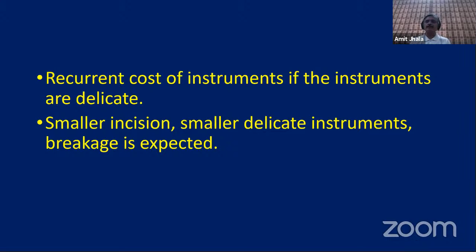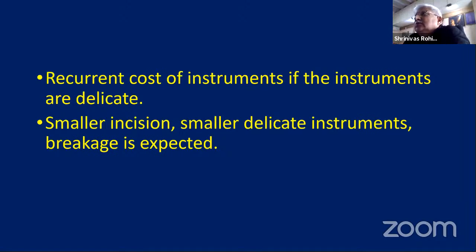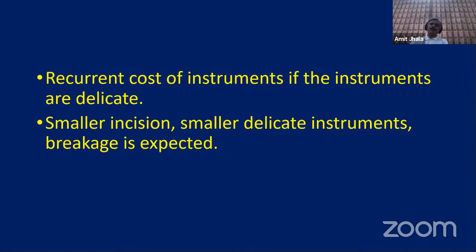Because if I do a transforaminal, I will have the whole set of scope and burr and instruments, which are different. In Destandau, the total instruments are different. Of course, the fewest instruments are in Destandau, and in microtubular you will again have a whole set of instruments. So the question is the recurrent cost of the instruments.